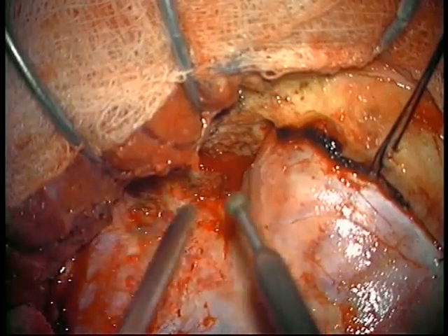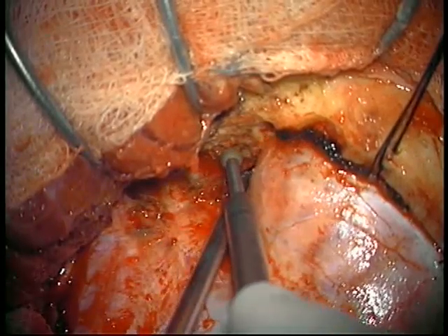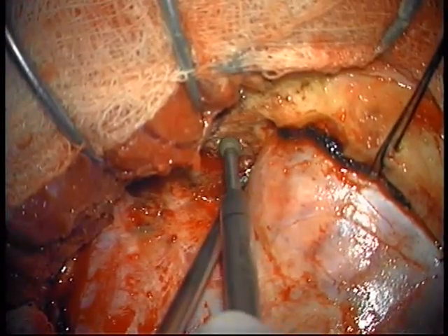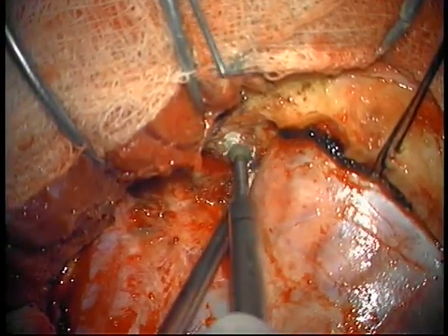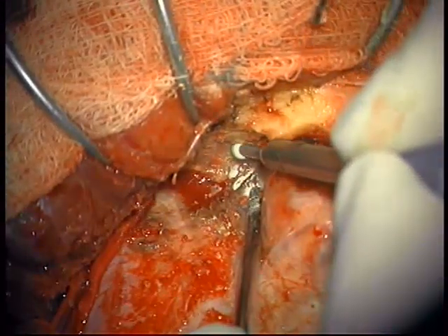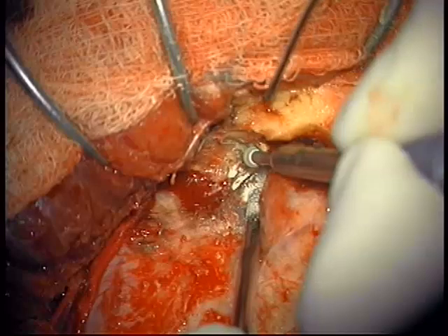This technique is as follows. At the beginning, we drill the sphenoid ridge, the anterior clinoid process, and the roof of the orbit until the periorbit is exposed.